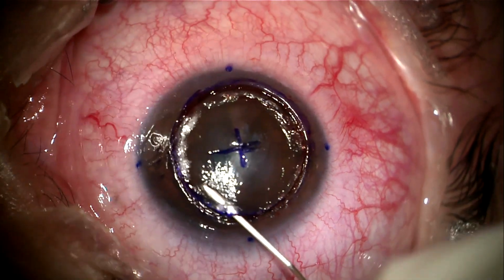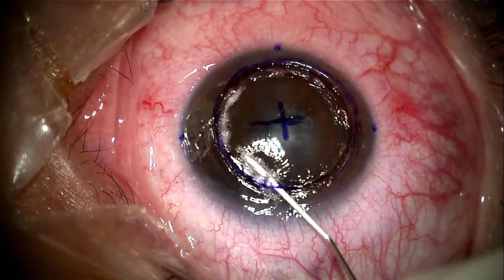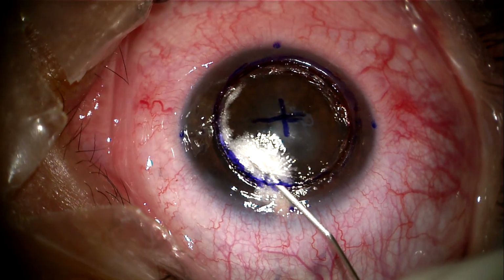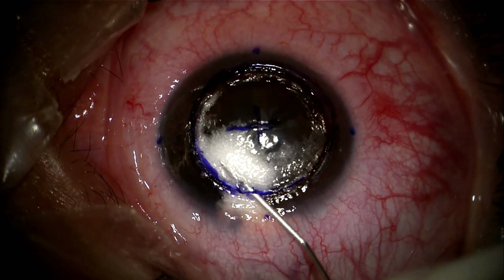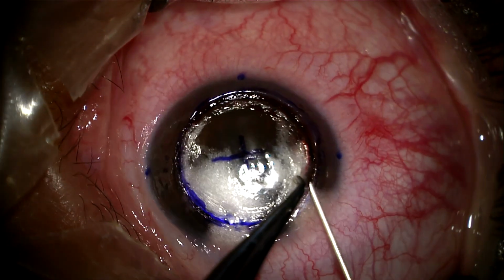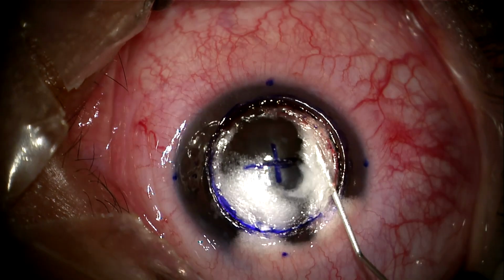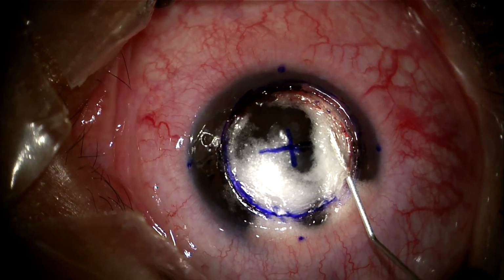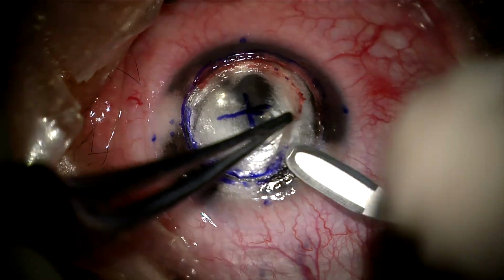So after the usual central marking and adding some peripheral marks to include all the thinned areas in the trephination, and after partial trephination is done, air is injected into the peripheral stroma to whiten the stroma, not aiming for formation of the big bubble. But when injecting air near the corneal scar, a type 2 bubble has formed.